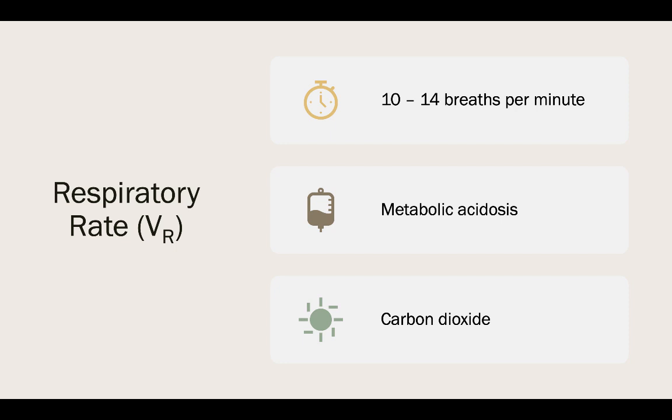If we were just to knock you down right now and put you on a vent, we'd probably need 10 to 14 breaths per minute. We're also going to base that and look at carbon dioxide levels. We're going to be monitoring end tidal carbon dioxide levels. If carbon dioxide starts going a little bit too high, we'll speed up that breath rate. Starts going a little bit too low, we'll slow it down a little bit. So we'll be watching our monitors after we set it. We're going to be setting this vent, seeing how the patient responds to it, and then adjusting accordingly.